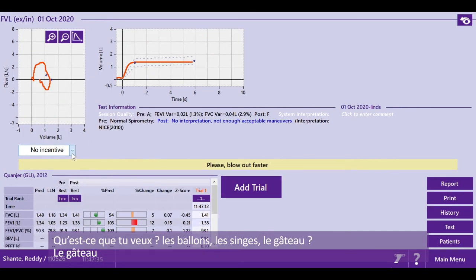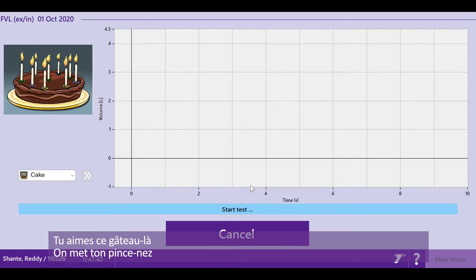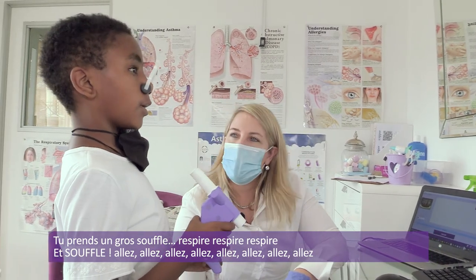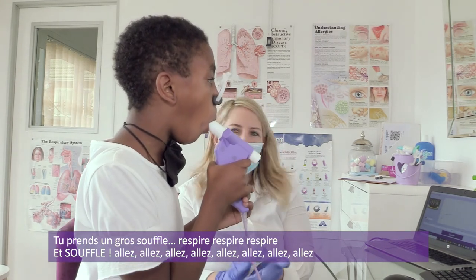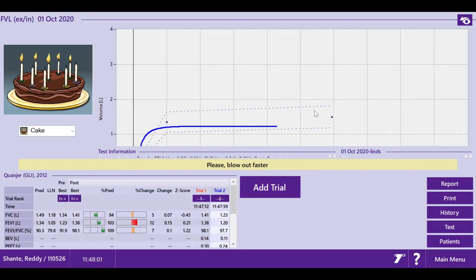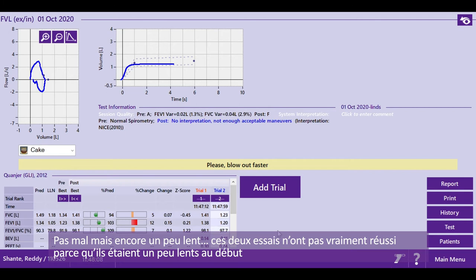So what do you want? Do you want the balloons, the monkey, the cake? The cake. You love the cake. Good. All right. Let's put your nose clips on. Are you ready? Yes. All right, big breath in. Fast as you can, in your mouth. And breathe in deeply. In. And rest. Good. Okay. Not too bad. Also, still a little bit slow.